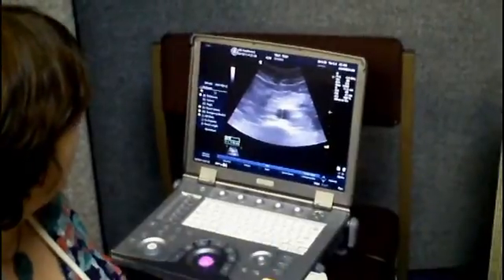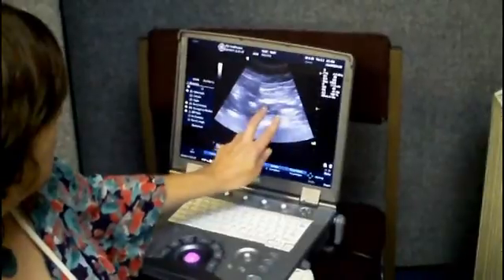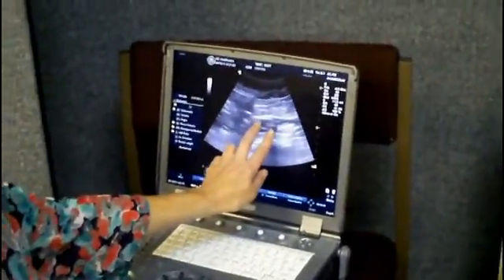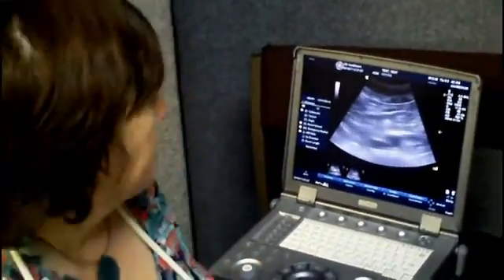I'll just show you down to where the artery splits in two — to the bifurcation. Some of you might be able to see it just splitting there, and that's as low down as we go. And that's all that there is to it.